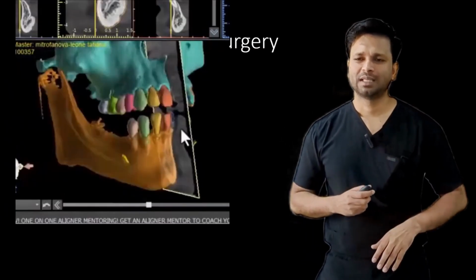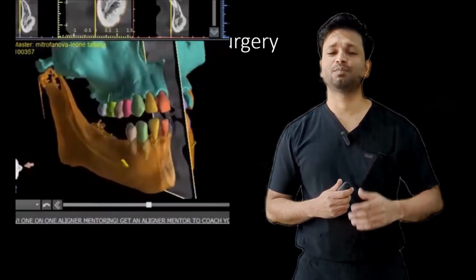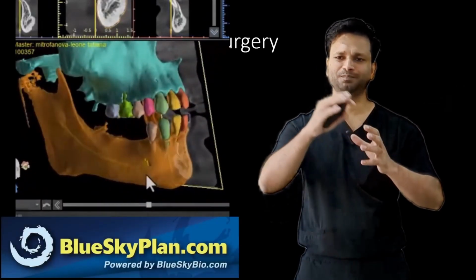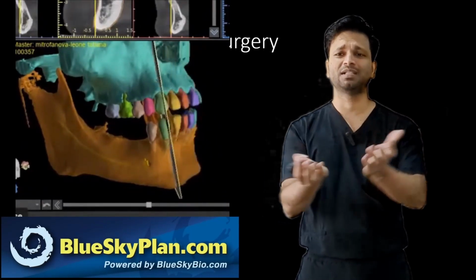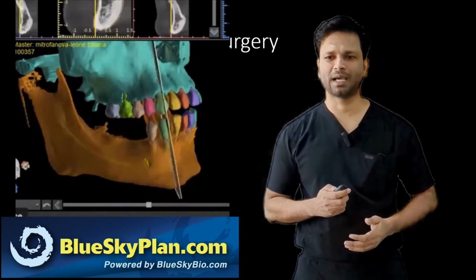Again, the same functionality is available in the software Blue Sky Plan. You can see in this video that the maxilla, mandible, the nerve, and multiple teeth are automatically segmented. This is a functionality that is available in Blue Sky Plan.